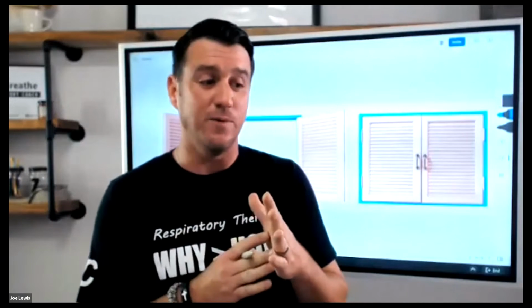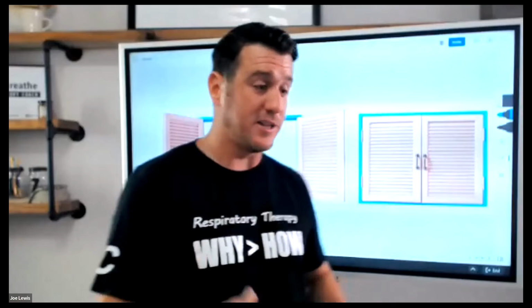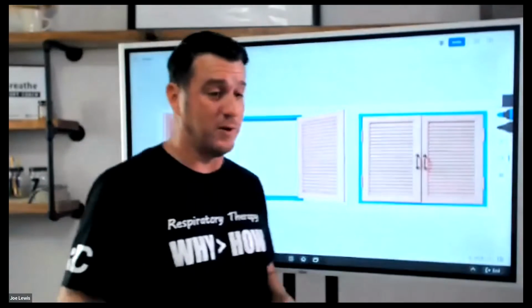You know, we sit around and wait till our PF ratio is 110 and then go, oh, we need more PEEP, we need more PEEP. Well, wait a second, let's just stop here. As soon as that person goes onto mechanical ventilation, what if optimal PEEP maneuvers were performed to find out what their optimal PEEP is, instead of trying to open up de-recruited lungs and non-compliant lungs? Just a thought. So optimal PEEP is one element.